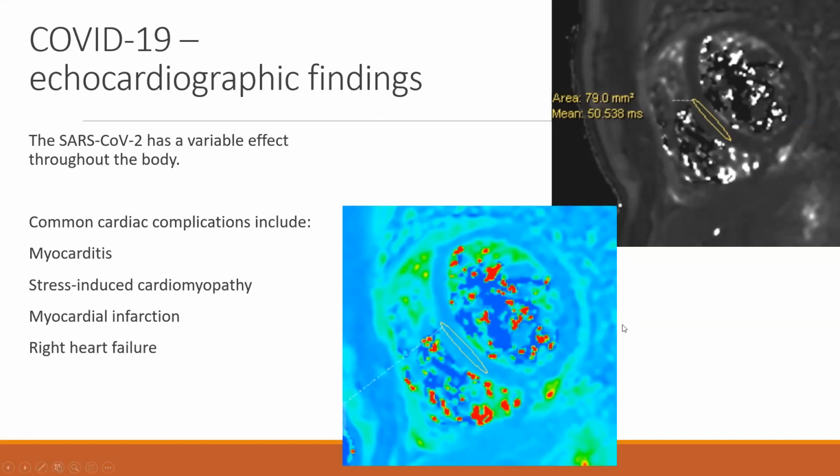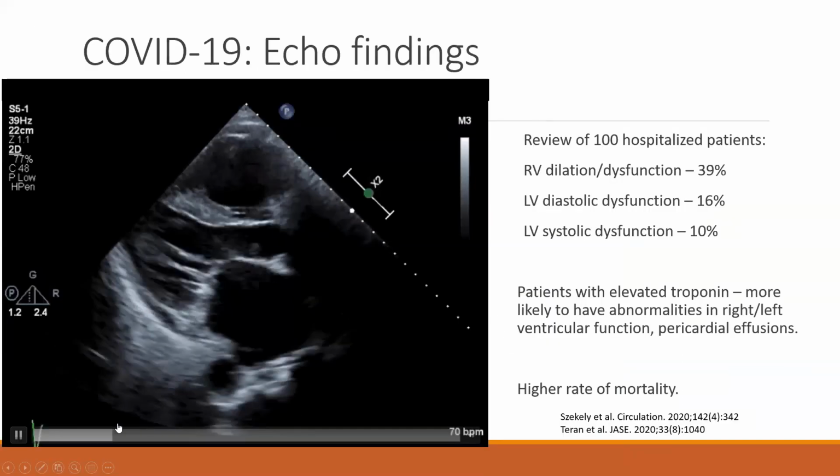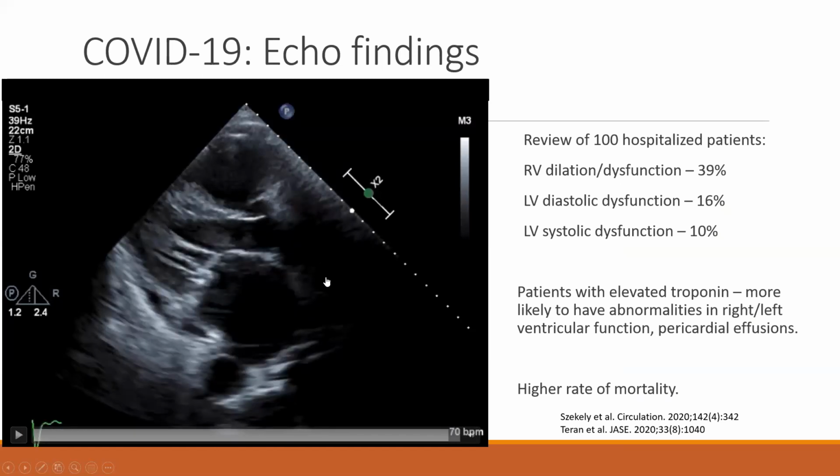This is an MRI demonstrating edema in the setting of myocarditis. The echo findings of COVID are variable, and we're learning more every day. But in a review of 100 hospitalized patients, nearly 40% of the patients in the hospital had some sort of RV dilation or dysfunction. Left ventricular dilation, left ventricular diastolic or systolic function was less common, but certainly could be present. Patients with elevated troponin were more likely to have abnormal echoes, which I think makes a lot of sense. But patients who had both elevated troponin and abnormal echoes had a higher rate of mortality.